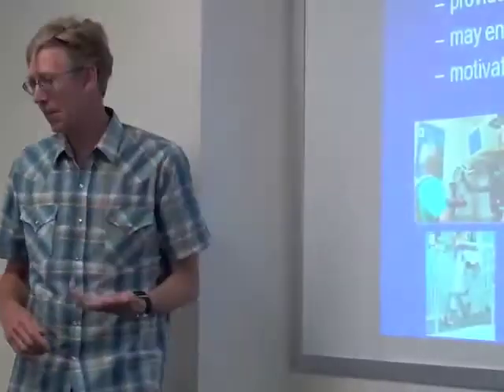All right, so now I'm going to give you a quick glimpse of the state of the field. What do the robots do? How do you help someone recover movement? The primary thing that robots have implemented so far is just assisting people in moving. The rationale for that is it helps stretch out your soft tissue. People have spasticity, which is hyperactive stretch reflexes, and if you stretch muscles, it can reduce spasticity, at least temporarily.